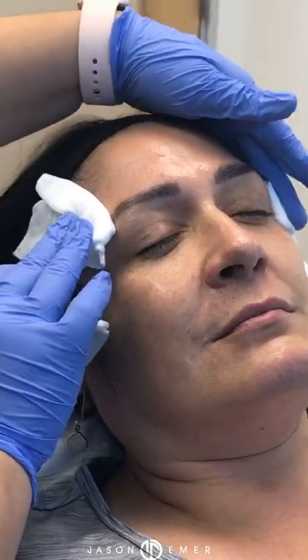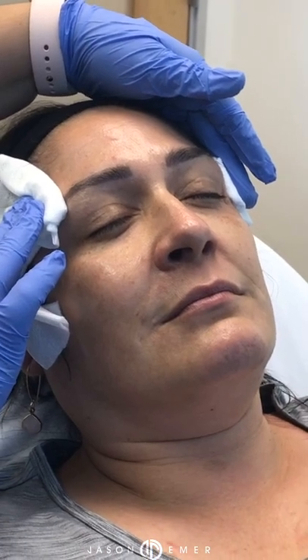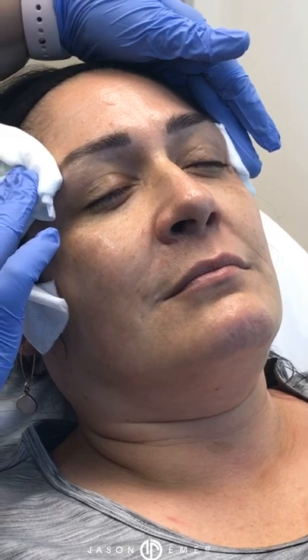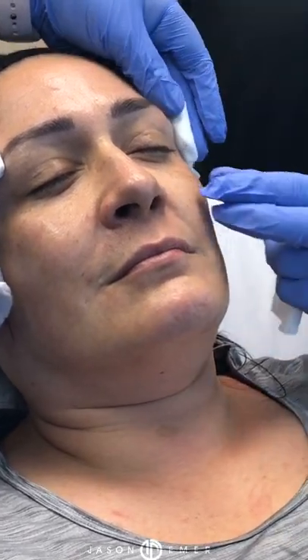Perfect. So that's all done, and you can see bloodless. Go ahead and hold. What kind of filler are you using? That's Radiesse, that whitish milky substance is Radiesse. And what that does is, hold on, I'll tell you 1 second, that gives much more collagen production because it's made of a calcium base. I like it in the bony areas, like we did in the temple there, so we can get a lot of lifting and we can get a lot of long-term collagen.